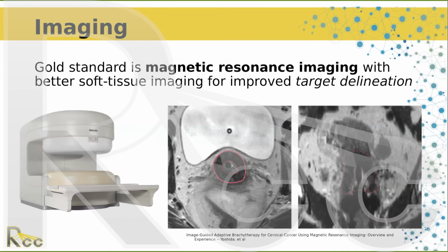It's a newer thing, and it's surprised me. Some of the participants in the past have actually been doing MR. MR is an expensive modality, but the prices are coming down on these units, and over here I have a permanent magnet style MR. This is the gold standard for soft tissue imaging, and really allows you to fine tune your treatment.